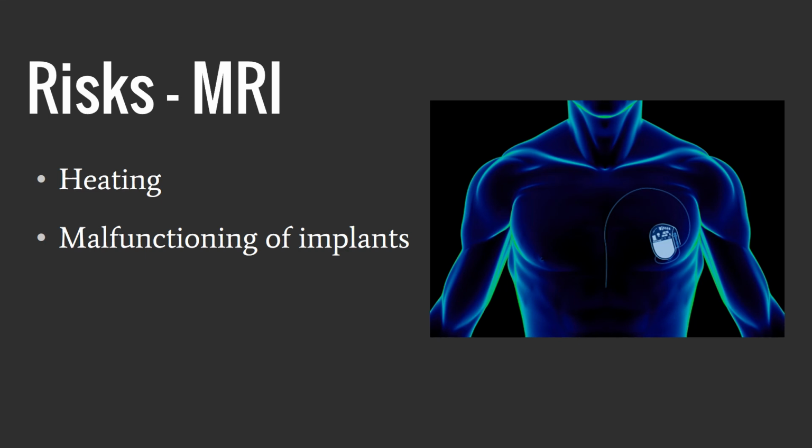Now, the heating can also raise body temperature, and it could affect an unborn child. So therefore, it is not used for female patients less than 3 months in pregnancy.